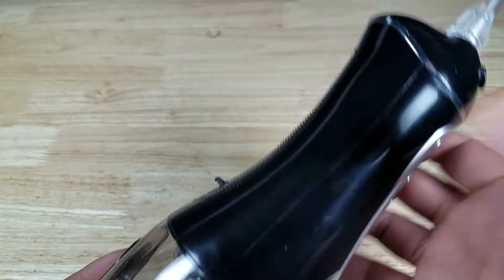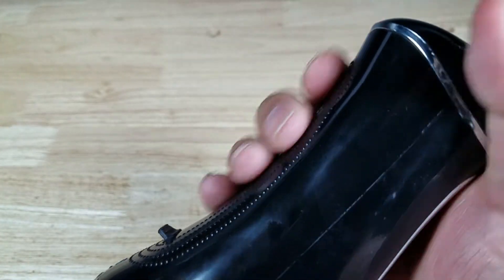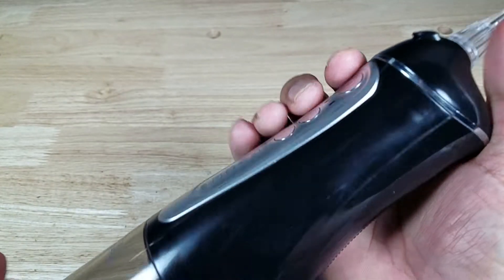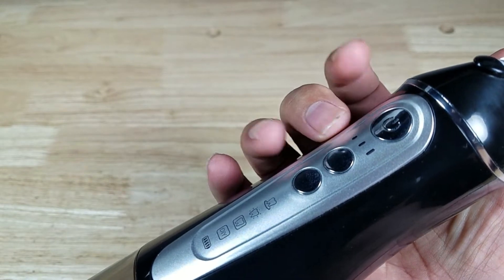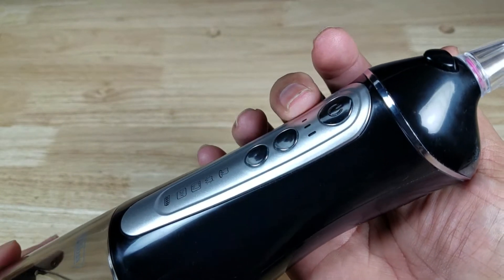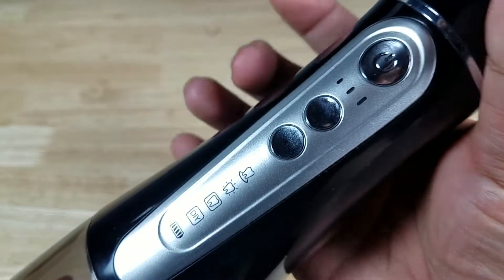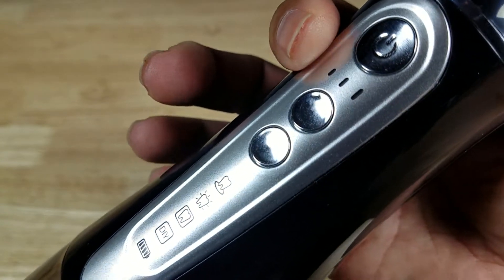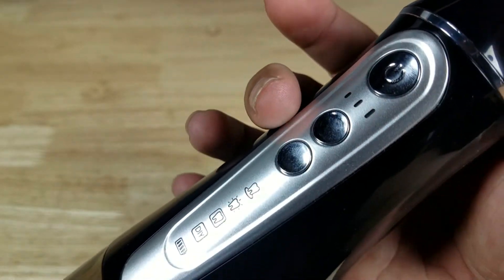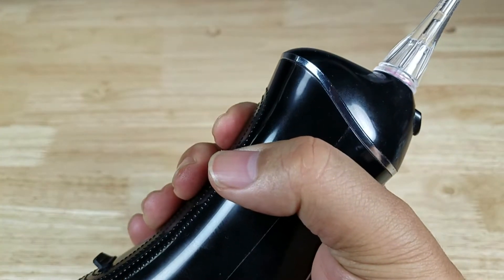A couple of things about the controls. When it's in your mouth, I like to grip it on the backside, because if you're gripping it the other way and you hit the intensity button and it jumps to three, it's really uncomfortable. I've also had it happen where I've hit both buttons, the control goes up to three, then it goes to jet mode, and it feels like I have a literal fire hose in my mouth. So just mind where your fingers are.